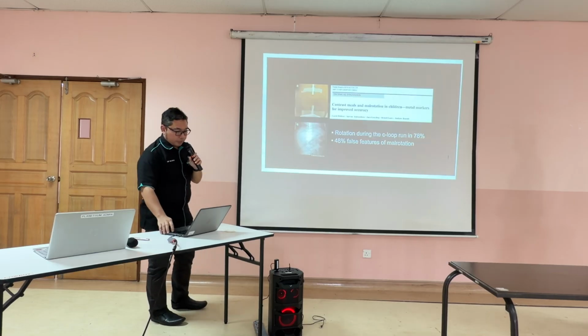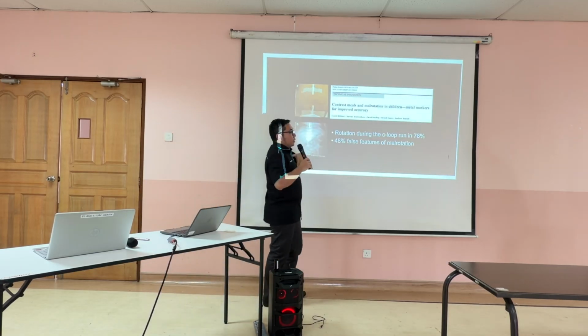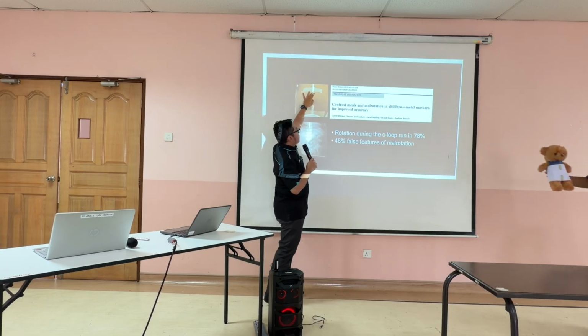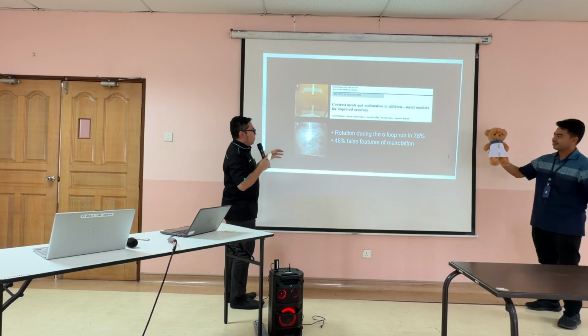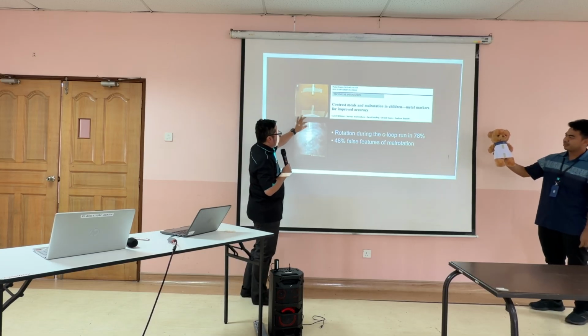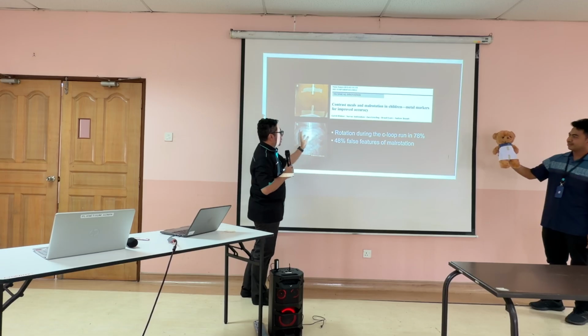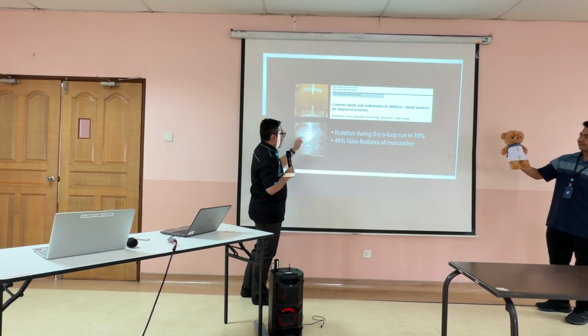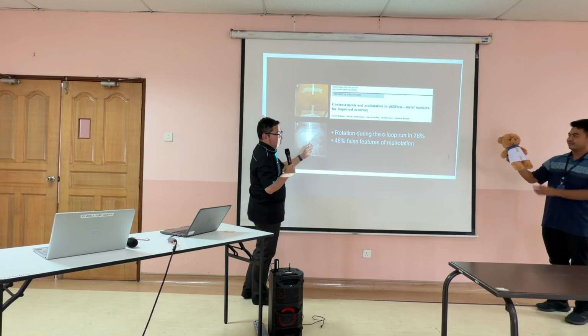So what we can do is put a marker below on the xiphoid sternum and also at the umbilicus. When you get the images, you will see the marker on the true lateral. If the contrast is on the left side already, you can make sure this is not malrotation.